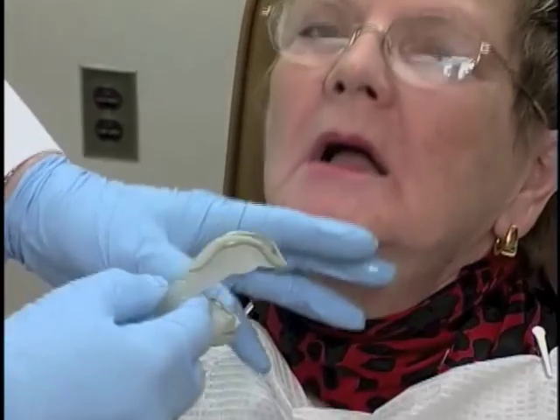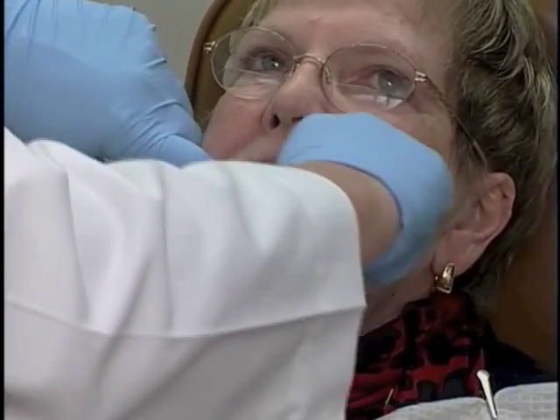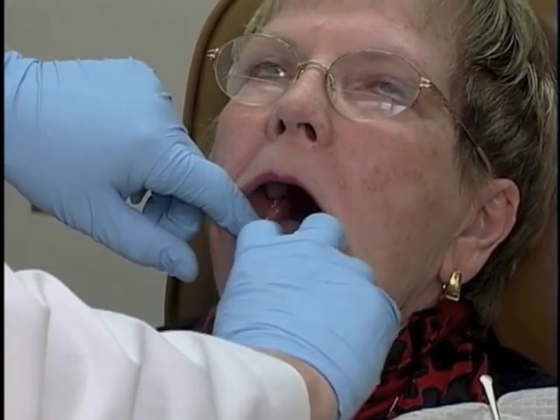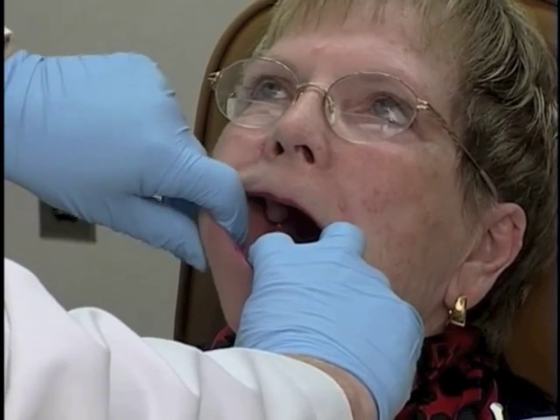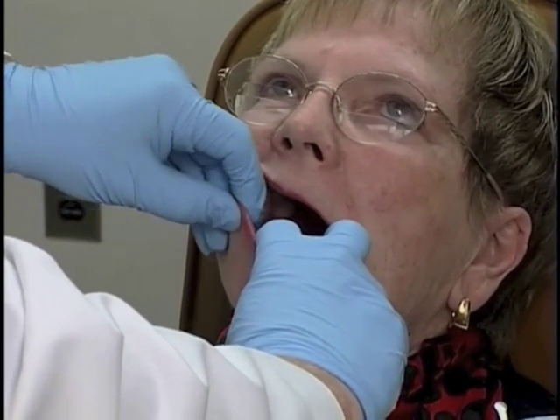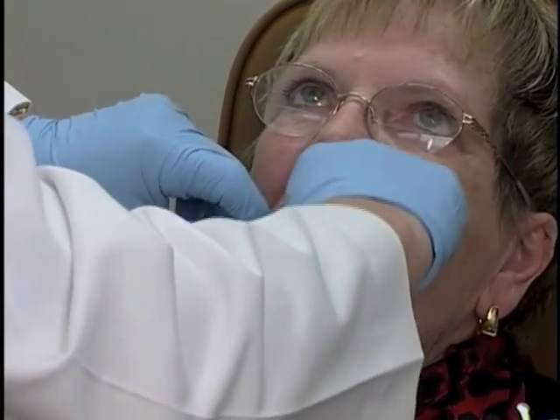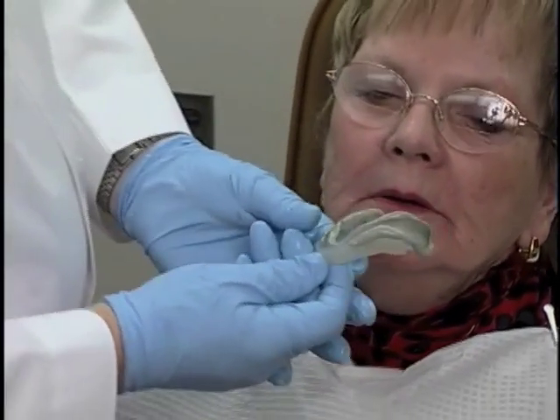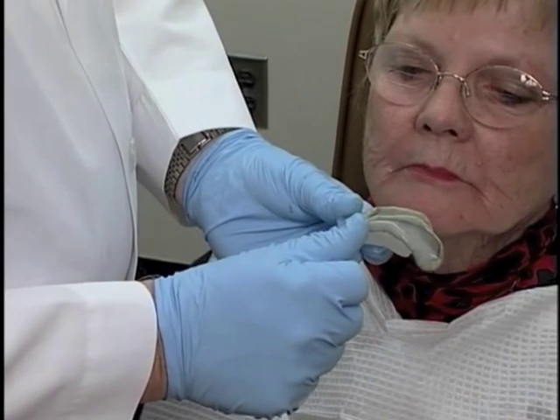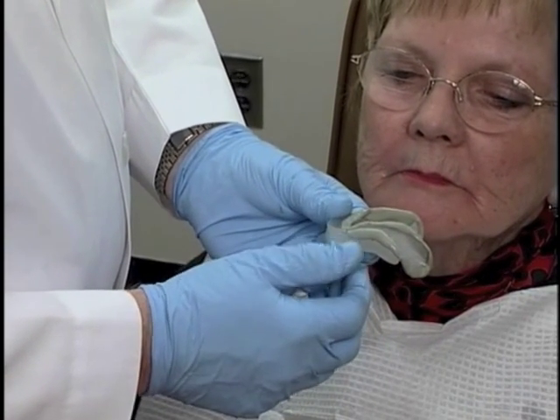And now we're going to border mold the right posterior area, which is the same as what we did on the left. And we pull the cheek up and anteriorly and posteriorly. And that gives us a nice rounded border molding from the retromolar pad through about the buccal frenum area.